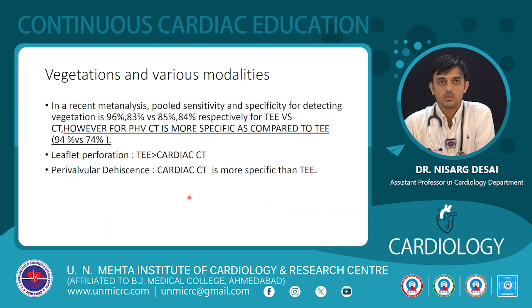Coming to the patients that are commonly referred here for infective endocarditis involving the prosthetic valves, which modalities to go for according to what pathology is being suspected.